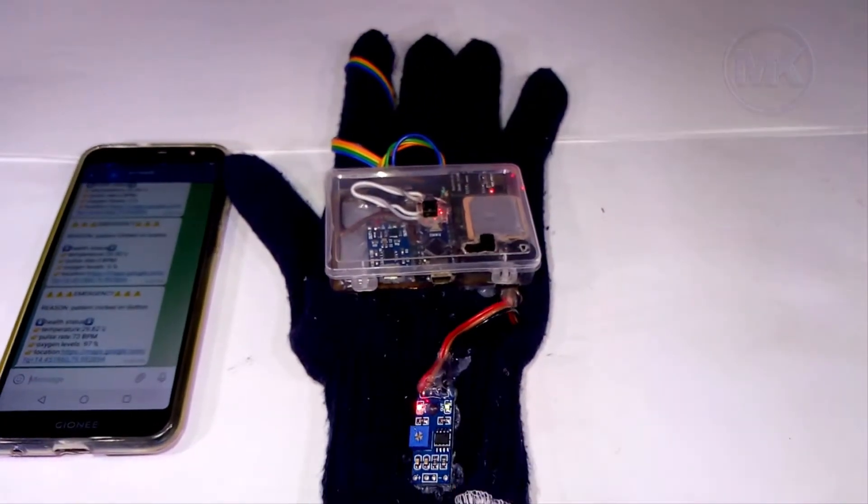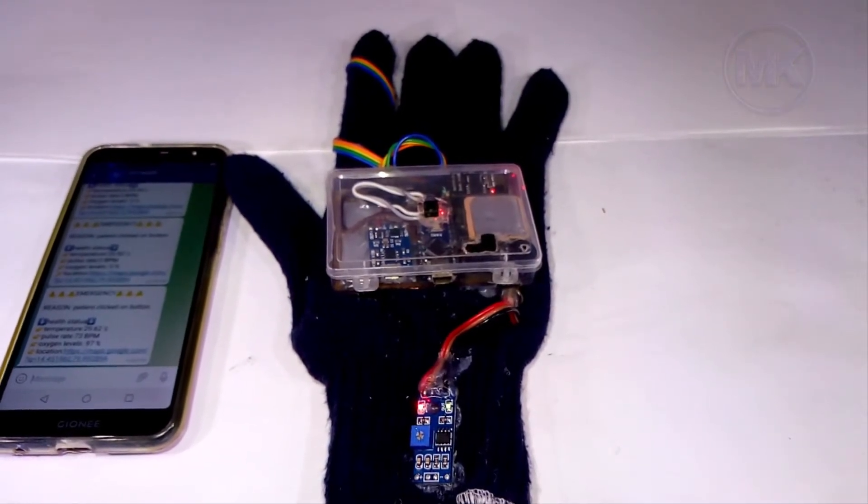You can observe that whenever I remove this glove, the buzzer does not make any sound because it is not able to detect any heart rate or pulse rate.